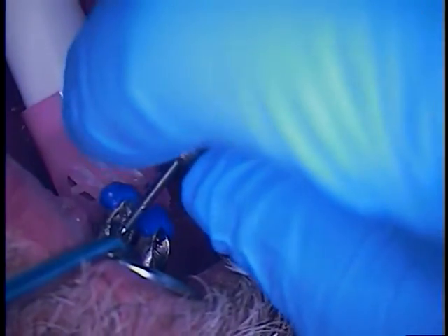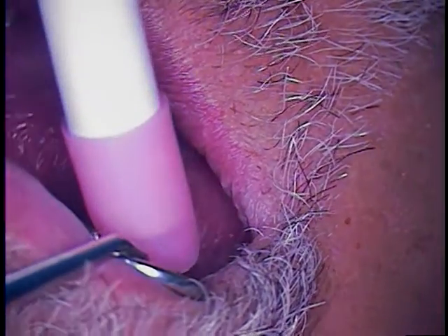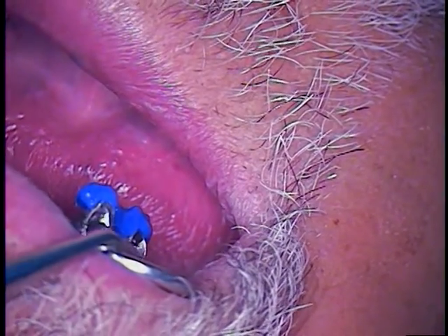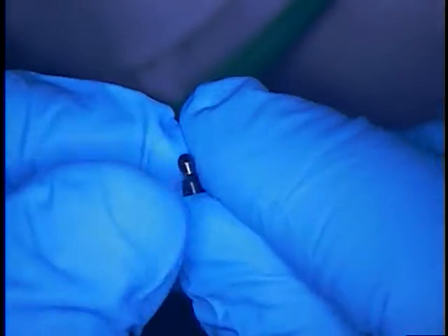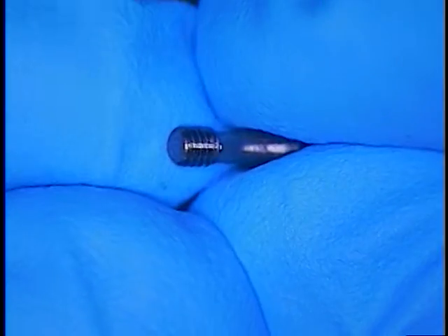So now we can bring in the high-speed suction tip. This is where I'm going to need to use a pair of cotton pliers. She's got it. Let's take a look at that screw. Thank you. I'll come right over here off the patient's mouth. She's just going to rinse it out. This is a basal screw. That's pretty much the shape of a basal screw. There are the threads. No problem with the threads.